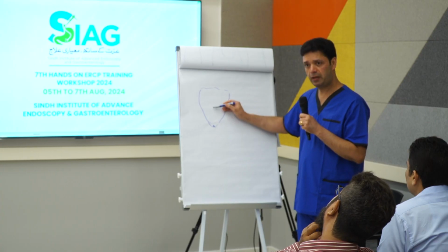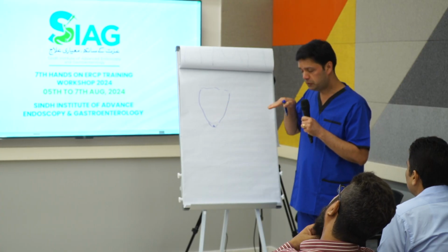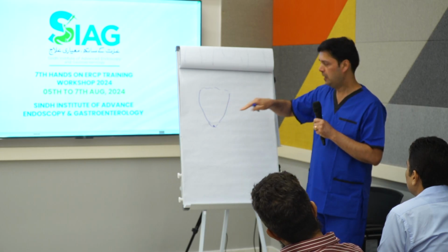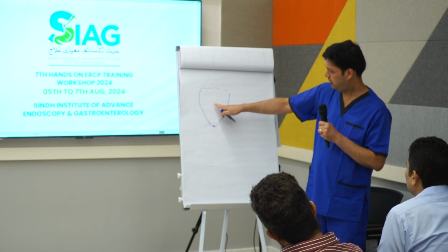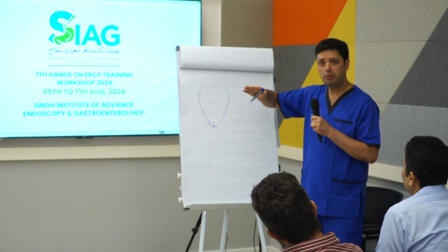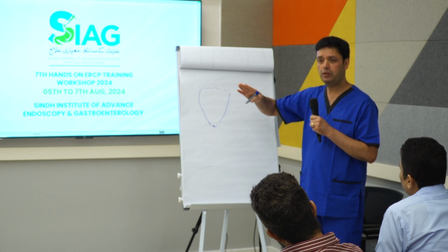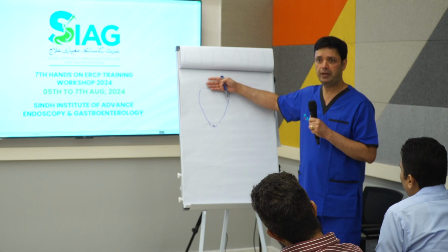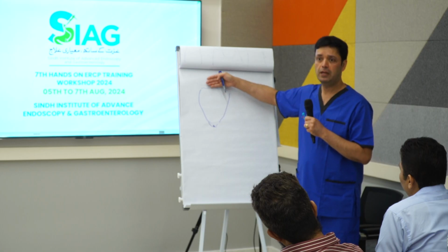Do a small sphincterotomy, then you take your sphincterotome inside, half bow, or if you pull it, then you'll know exactly. Again, it will come in the line of the duct, then it will help you to assess how much more you have got to cut. So it's about reassessment. Initially, you won't understand what is the limit of the sphincterotomy.